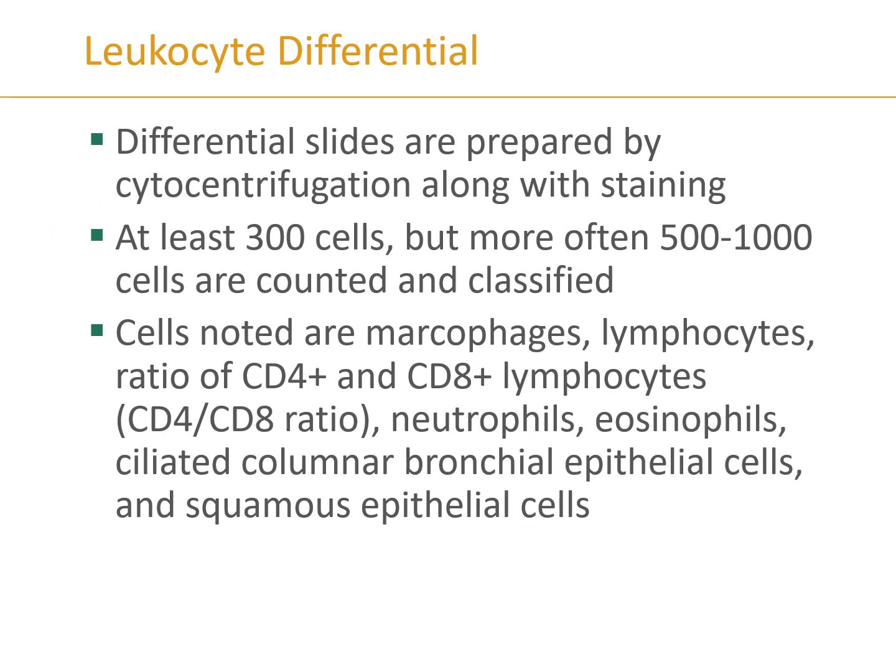Now once you do your cell counts, you'll also need to do a differential. So you will make a cytospin slide, and you will stain those cells and look at them to determine if there's anything suspicious, and you'll do those counts and get the average.